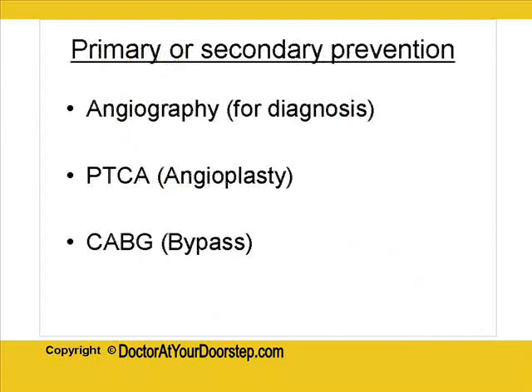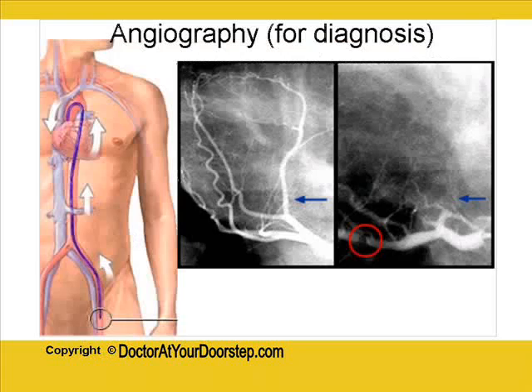Now we will see the three most famous words related to heart problems: angiography, angioplasty, and bypass surgery. I'll start with angiography first. At the very outset, I would like to inform you that angiography is meant for diagnosis. It is not a treatment by itself.